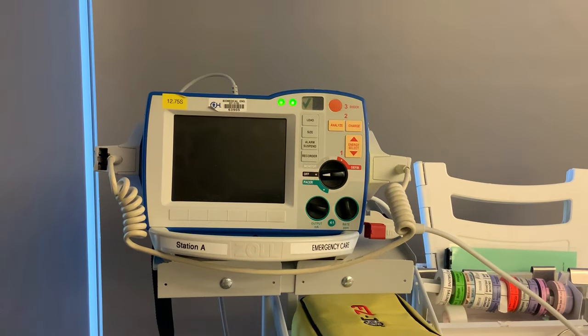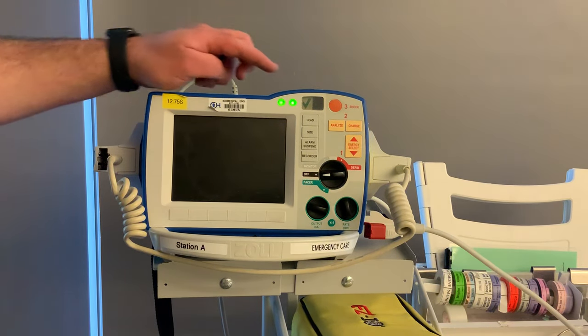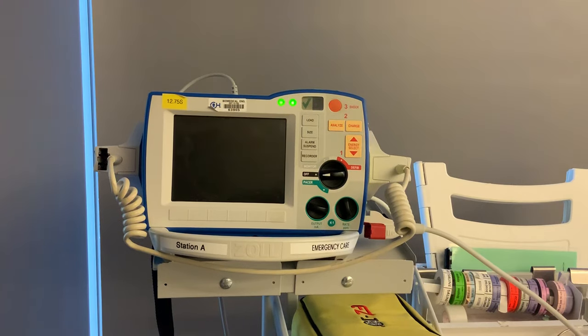We're going to go from the outside working our way in. The first thing I want you guys to look at is this little window at the top — it has a green check mark in it. That green check mark means the defibrillator did its self-checks overnight. If there's a red X in there, it did not do its self-checks, so either you have to do that or you need to get a different defibrillator.